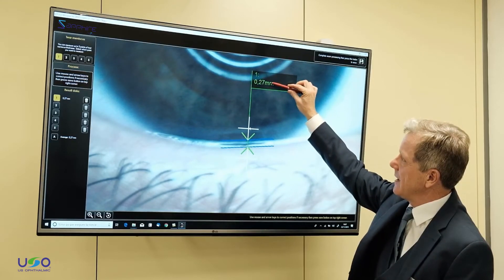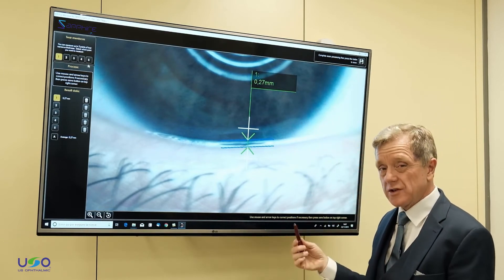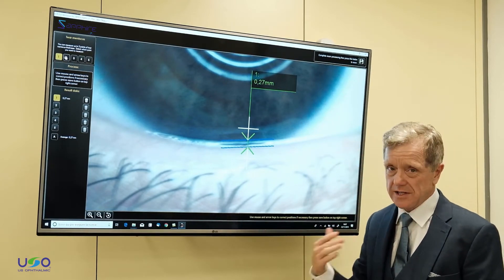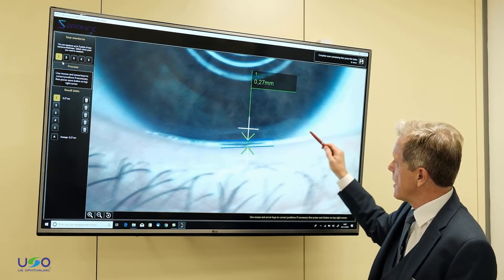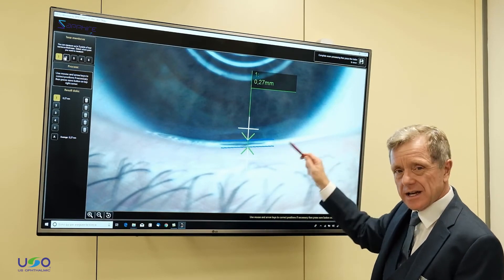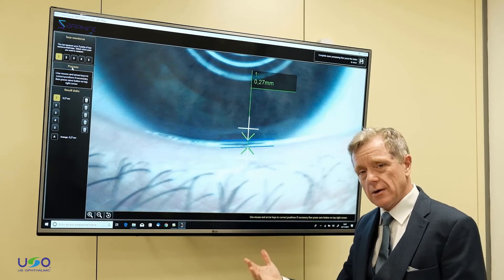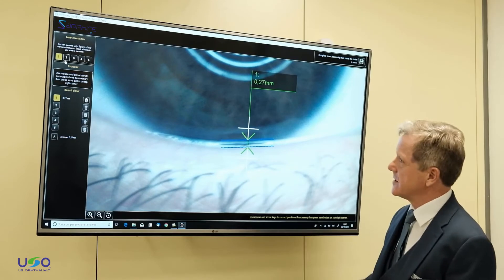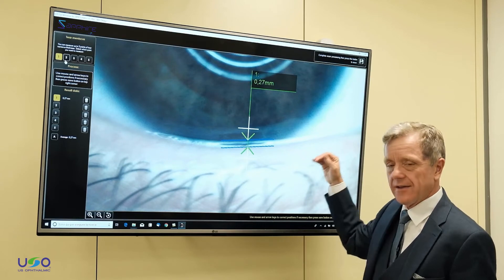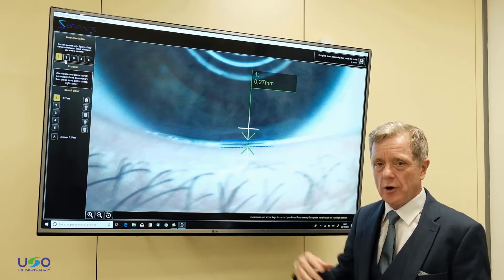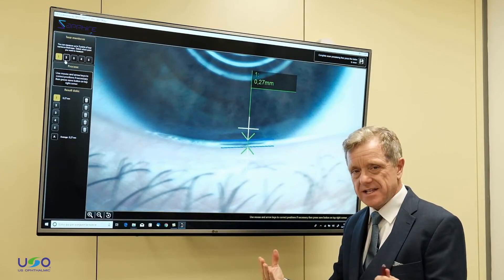It gives us a tear meniscus height — in this case 0.27 millimeters — which is a normal tear meniscus height. We can go further and actually analyze five different portions along the lower lid margin to determine the overall quality of that tear film and the quantity, the volume of the tears.